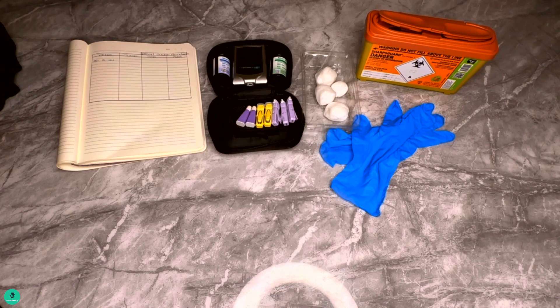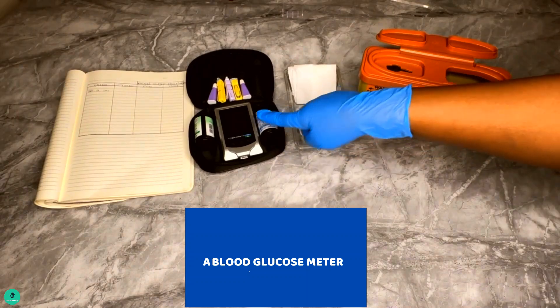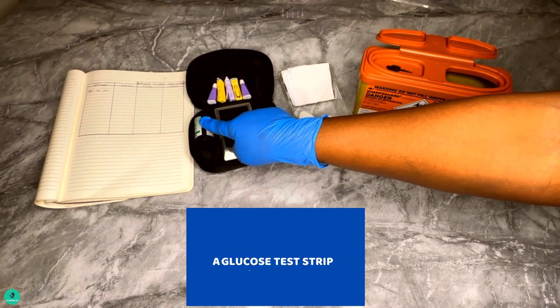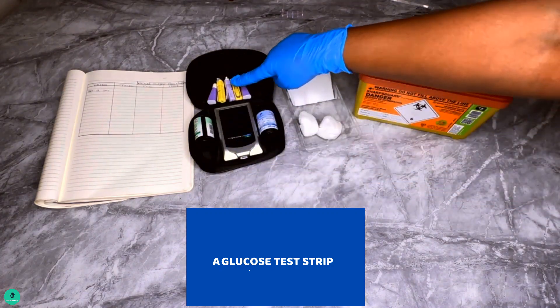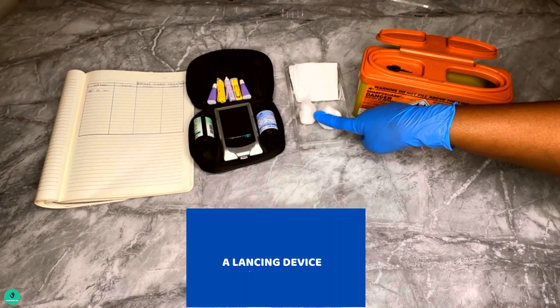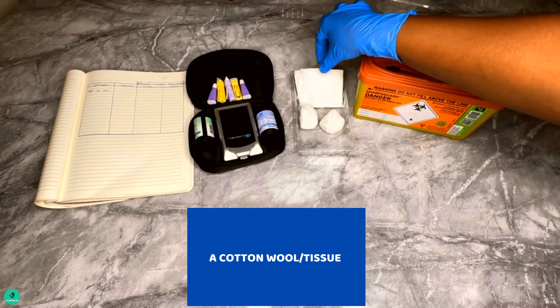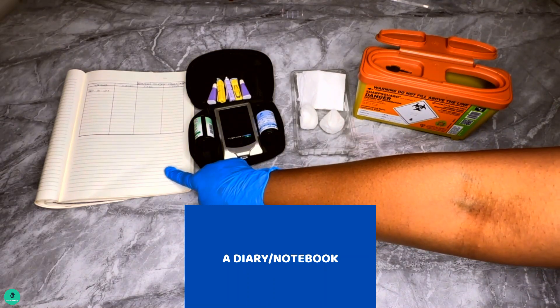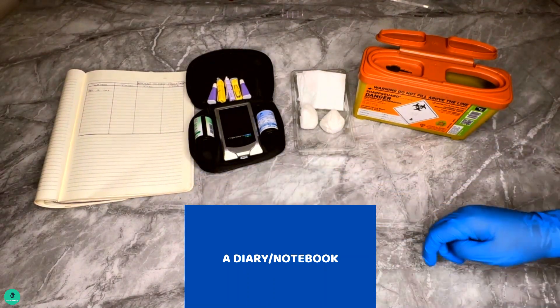How to test your blood glucose level. Number one: prepare your kit ready for testing — a blood glucose meter, a blood glucose test strip, and have a ketone strip ready just in case you need it, a lancing device, a cotton wool or tissue, a sharp bin, and a diary or notebook to record the results.